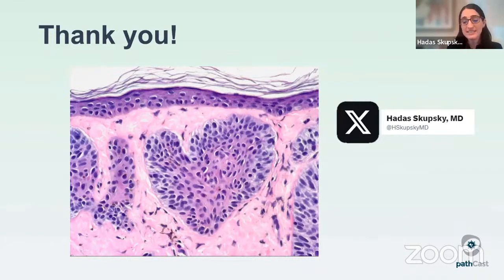Yeah, so we don't see epidermal lymphocytes in normal skin per se, right? So if you have a biopsy of just normal, non-inflamed, non-pathologic skin, you really shouldn't have lymphocytes in your epidermis. You do have antigen presenting cells in your epidermis, right? We talked about those Langerhans cells that were scattered in our epidermis, but in normal, the way our body is supposed to operate, those antigen presenting cells will make their way down into the dermis. Well, they will meet the lymphocytes that are kind of making their way through the superficial dermis to encounter antigens. They'll present their antigens. The lymphocytes will make their way back to the lymph nodes and so on. So really, you should not have lymphocytes making their way out into the epidermis in non-pathologic states.